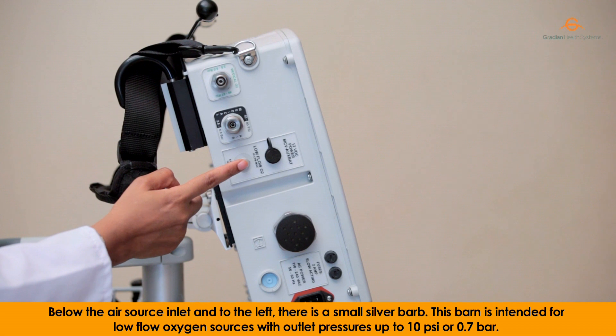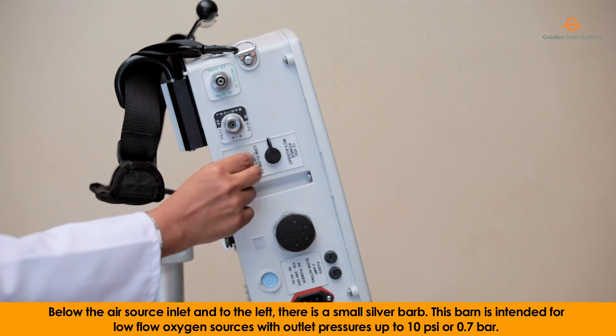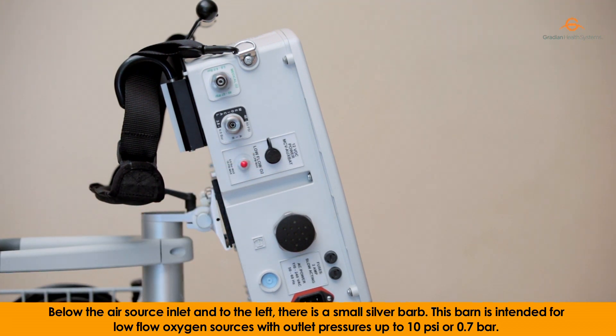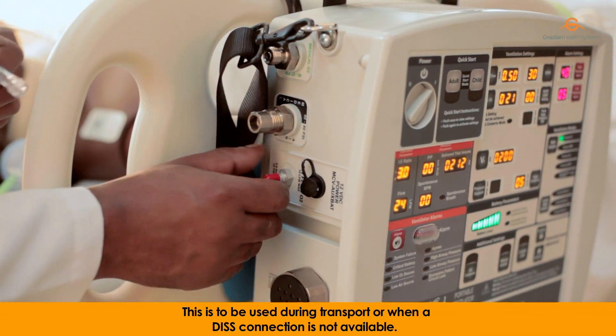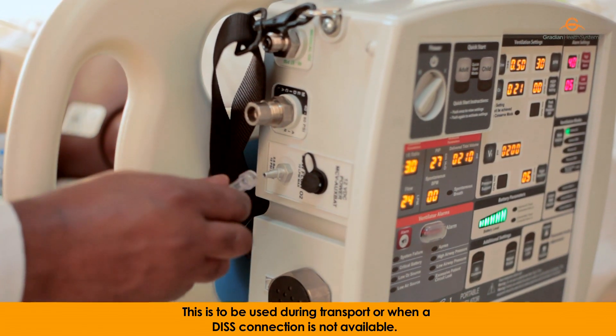there is a small silver barb. This barb is intended for low-flow oxygen sources with outlet pressures up to 10 psi or 0.7 bar. This is to be used during transport or when a DISS connection is not available.